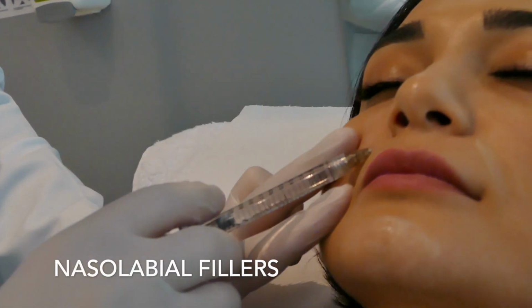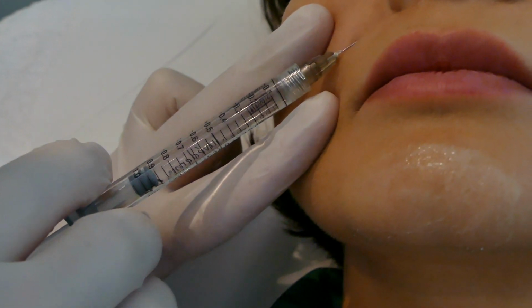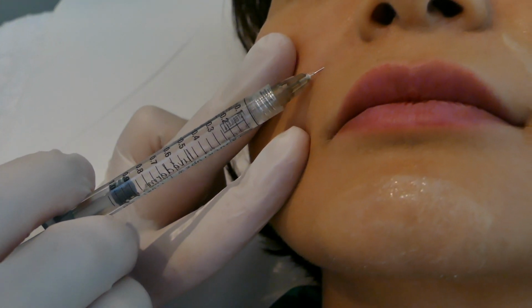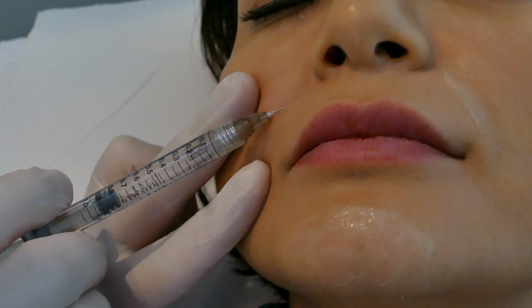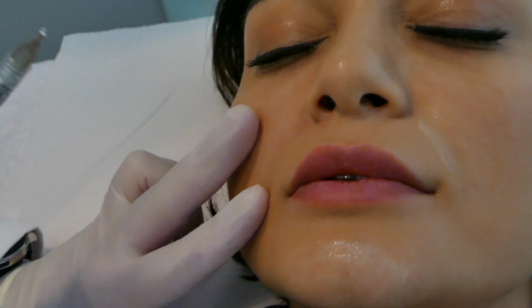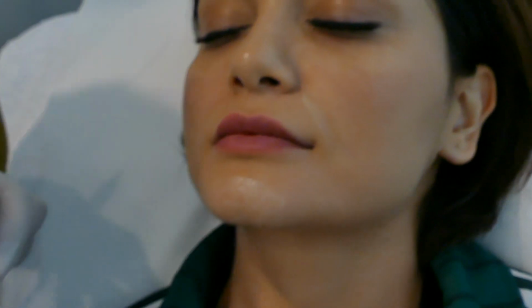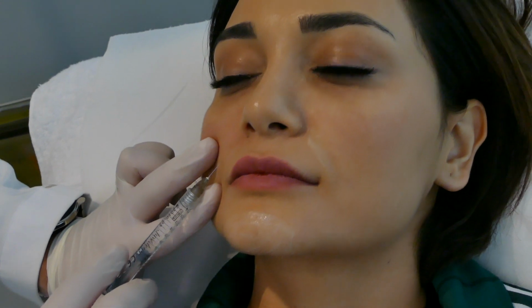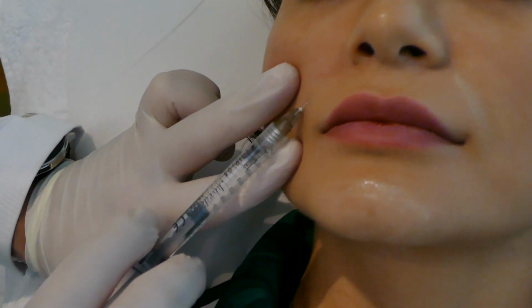This is nasolabial correction using fillers, and this is a grade 1 nasolabial fold with a deep depression in the upper third region. This is a fanning technique with small aliquots in the subcutaneous plane. The facial vessels are deeper than the subcutaneous plane, within the SMAS layer in this region.